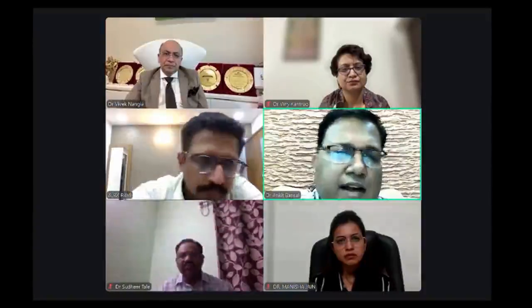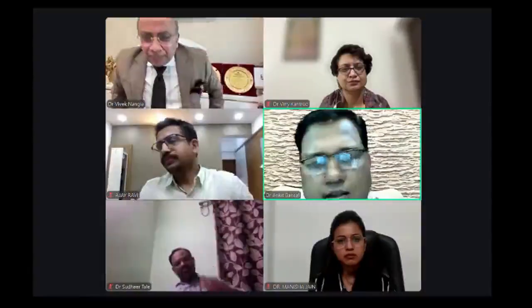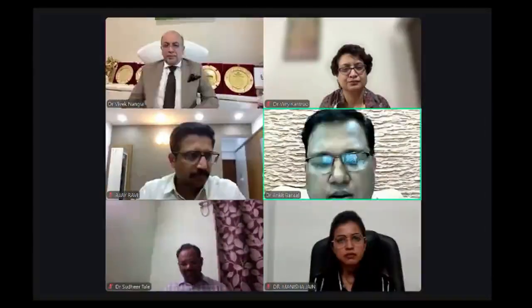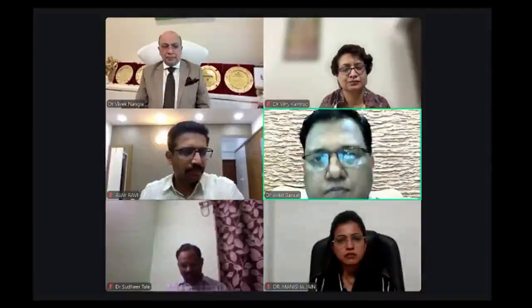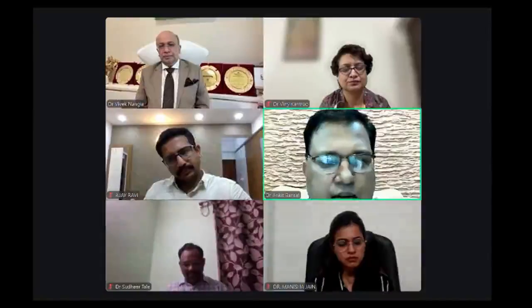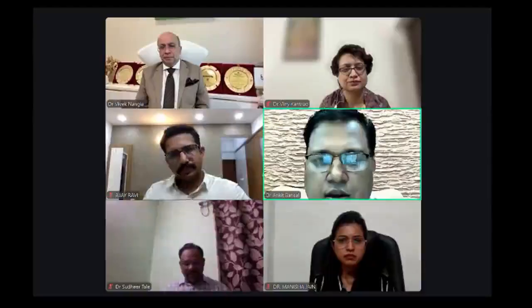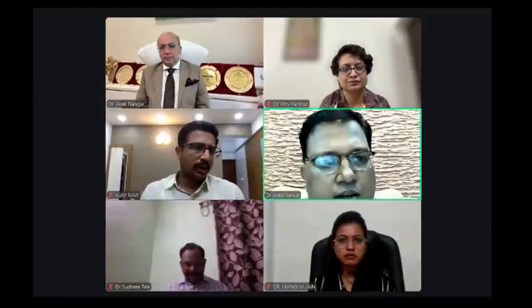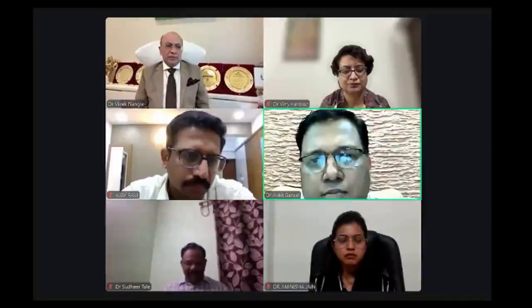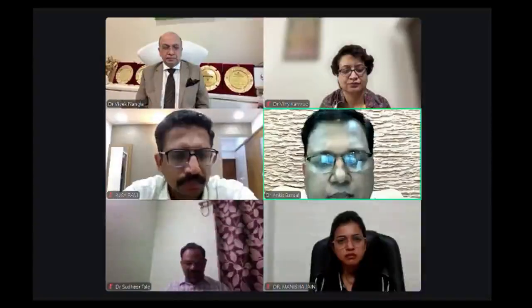Yes, sir. Sir, for any kind of diagnostic modality, life-threatening emergencies are totally not acceptable. So if you prepare yourself well before the procedure, I think you can have a smooth procedural workup. So in that, the workup is very important. Again, we can't forget our basics. Look for the platelet count, look for the INRs. If there is an antiplatelet and anticoagulation, stop appropriately before doing a procedure. Try to avoid the major blood vessels. Go for the peripheral lesions if you are taking any transbronchial samples.